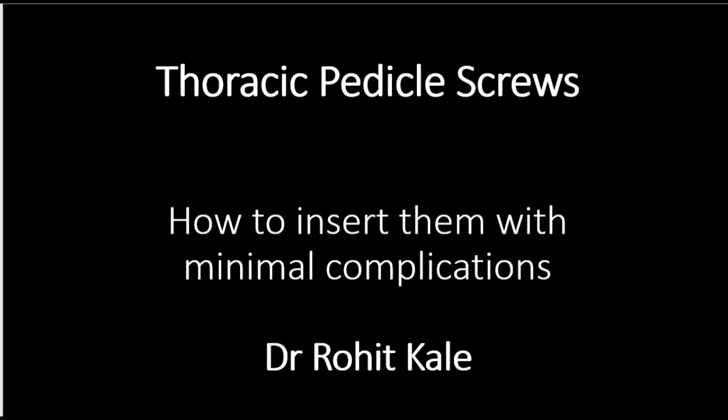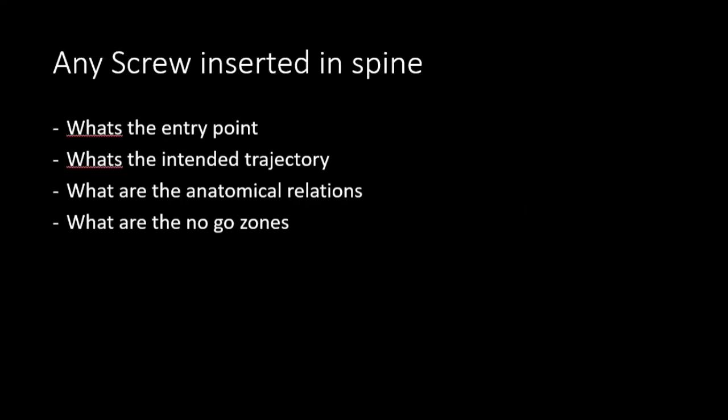Today in this video, we are going to discuss pedicle screw fixation. Any screw inserted in the spine has to be studied with a few points, like what's the entry point, what's the intended trajectory, what are the anatomical relations, and what are the no-go zones. Of course, you don't want to put the screws in the wrong position and injure important structures in the process. So basically, for any screw, what we need to study is what to do and what not to do.